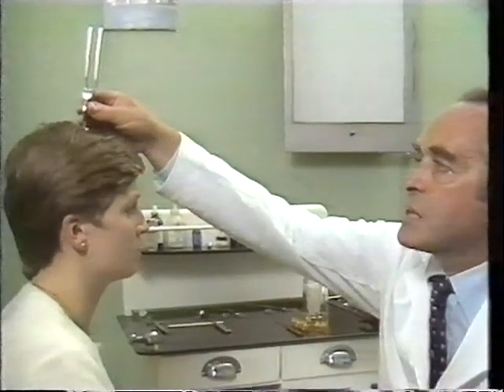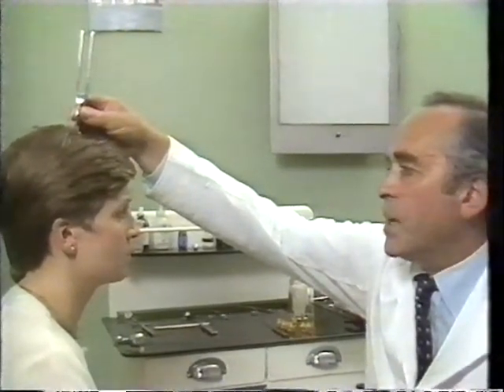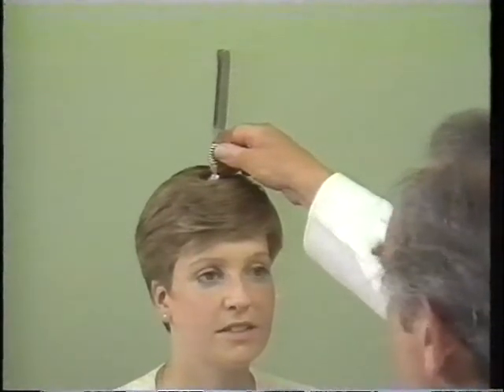Now, in the Weber test, the vibrating fork is placed on the vertex of the skull, and the patient is asked to lateralize or to say in which ear the fork can best be heard. I can hear it equally in both ears. Fine. Although these tests distinguish the type of hearing loss, its severity and the identification of the defect require more complex investigations. There are very many reasons for otological referral, and among them, stress should be placed on any patient with a sudden onset of hearing loss in one or both ears. Such a patient should be immediately referred for assessment and for treatment.